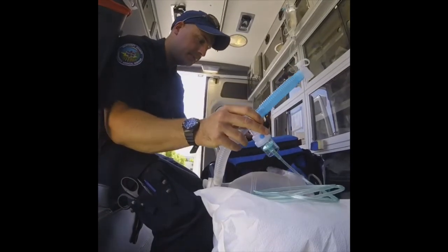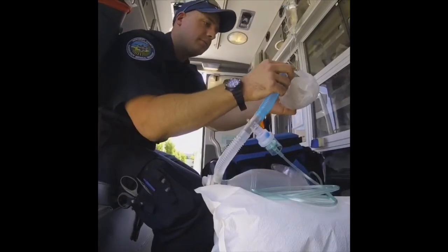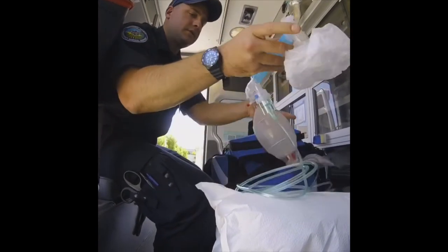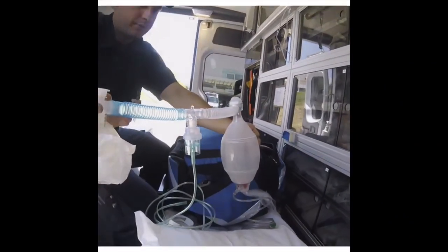The blue tubing comes out here, and we are all set to bag with the med neb.